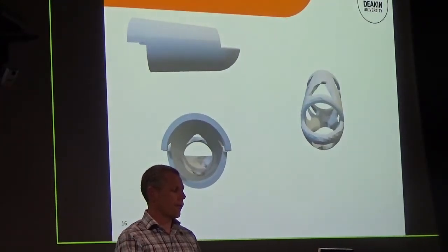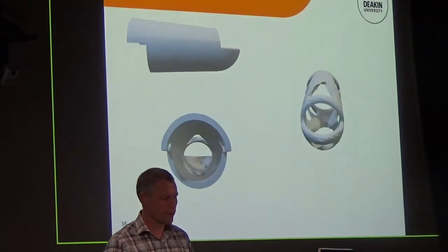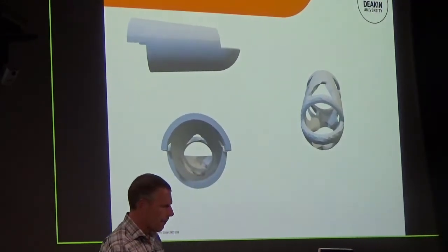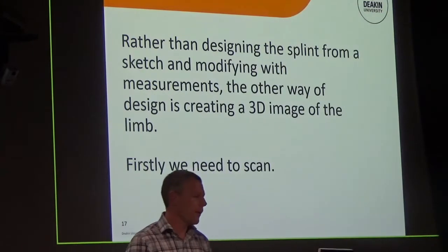So this has just been done. He literally sent me these files the other day, and we had a look at them. So hopefully that will get published soon to show that a mallet splint can be modified to this level before it starts to lose its strength. So we can modify things quite drastically through computer-aided design and draw them that way.